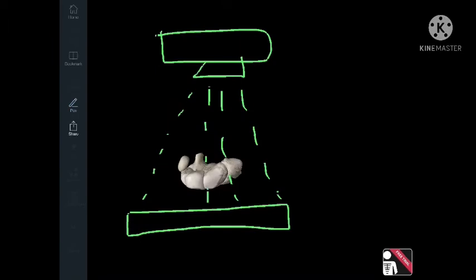Now here's the reason why the carpal interspaces are better demonstrated on AP projection compared to PA. The carpal bones are naturally in concave position on their anterior side. Placing the hand in supine makes the anterior side face the X-ray source, or our X-ray tube. The beam divergence of the X-ray will coincide with the joint spaces of the carpal bones due to their concave position. Therefore, the beam can pass through these joint spaces well and they will appear open on the radiograph.